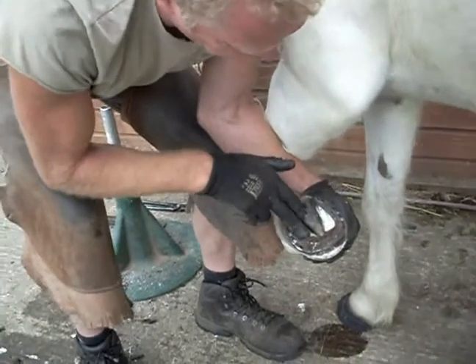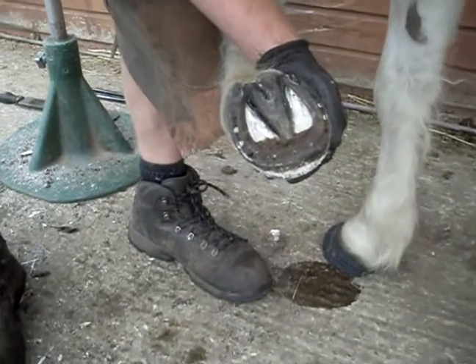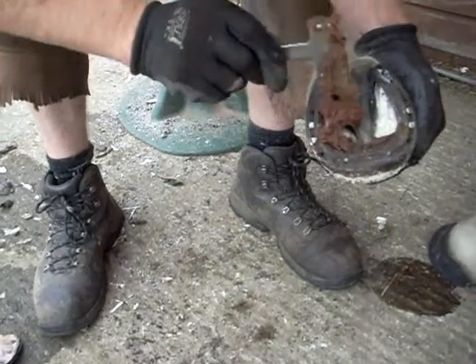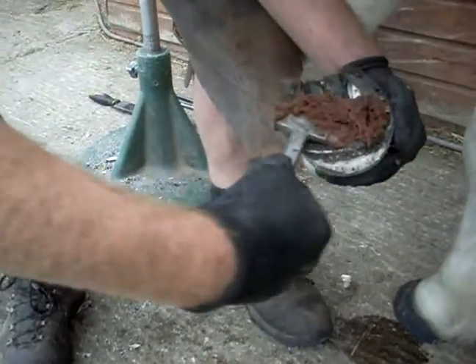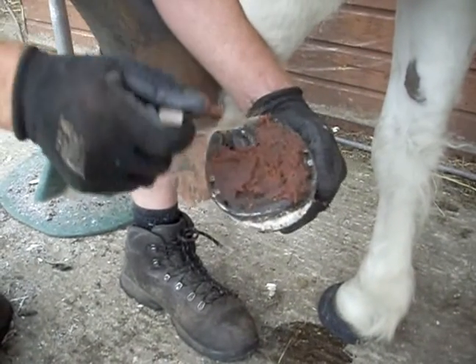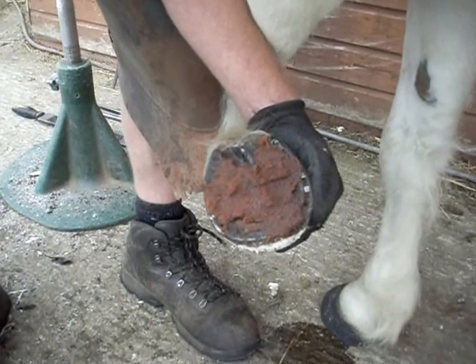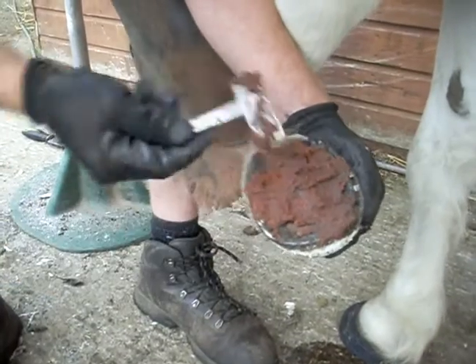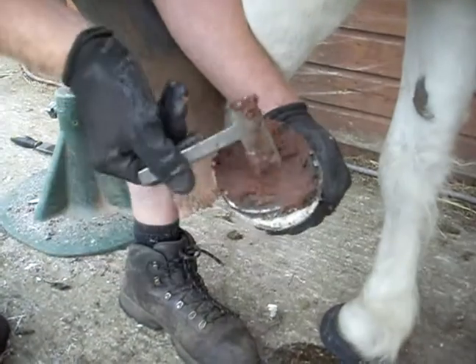I've nailed the shoe on. We've got the hoof packer under this broad, seated-out area here. So what I'm going to do now is just fill this area up with some more hoof packer. This is a different one I'm using this time because it has analgesic properties — a bit of a painkiller — and it's supposed to help with pain relief for laminetics, at the same time offering good support.